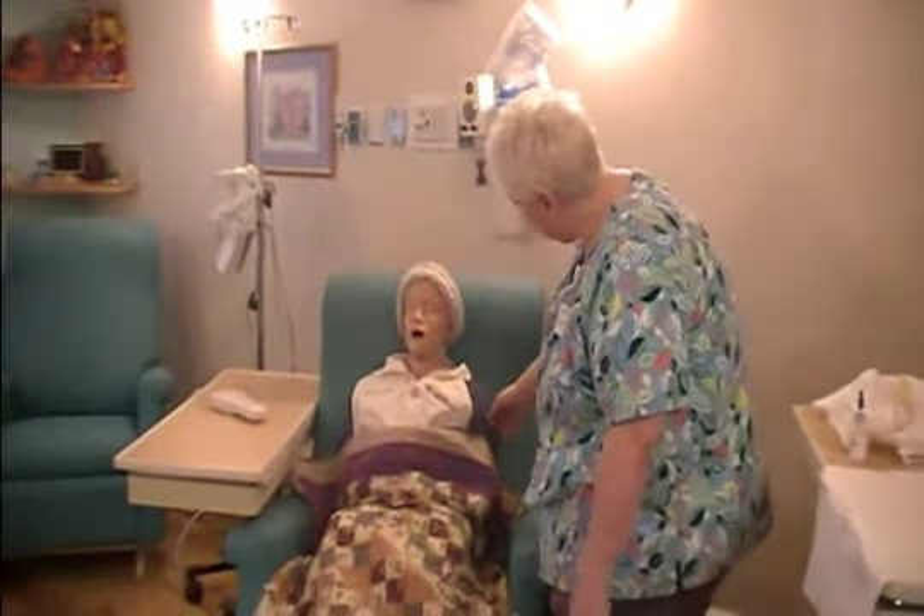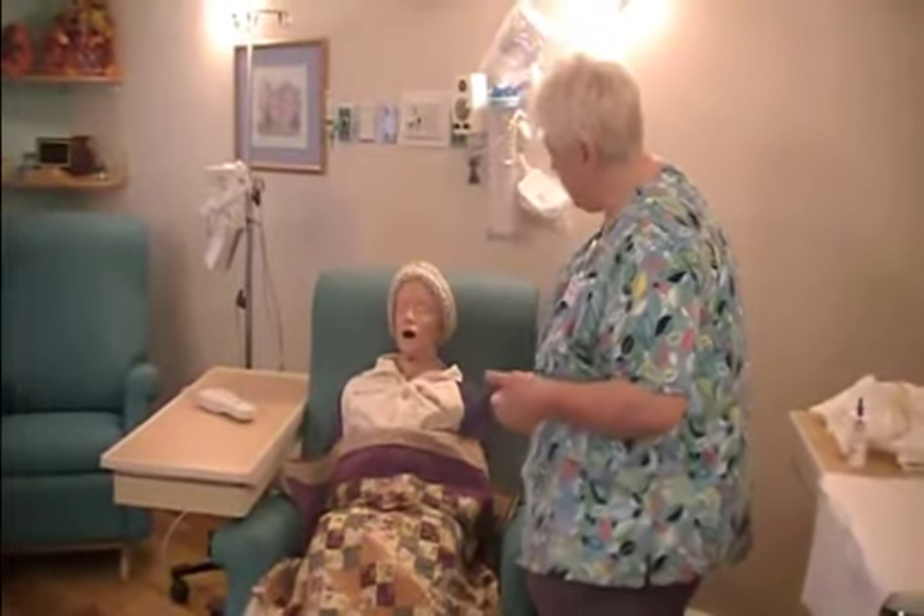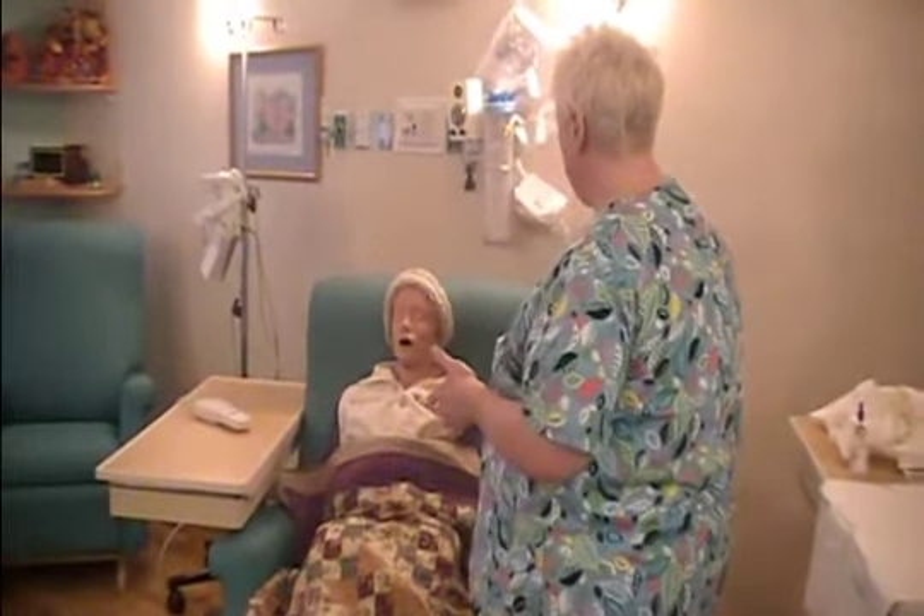Hi, my name is Cindy. I understand that we're going to do a port draw on you. Can you tell me a little bit about your port?